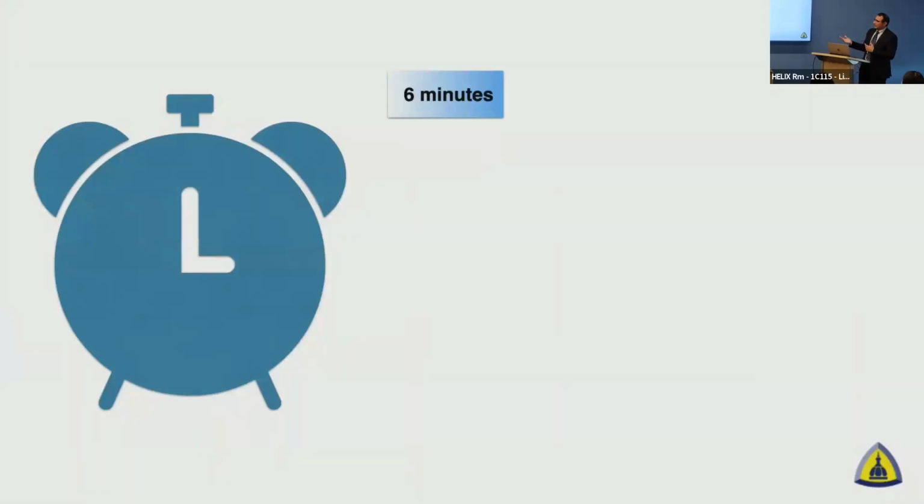And then I started doing 6 minutes for our surgical candidates, for preoperative mapping. And then at one point, I thought I needed to quit my job because I was not getting very good results. Some patients, I got beautiful results.